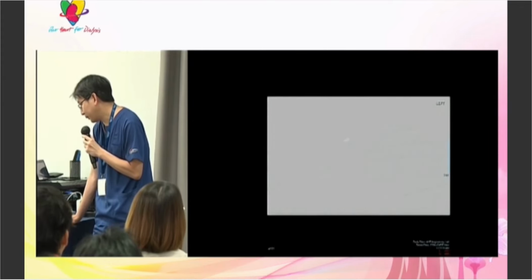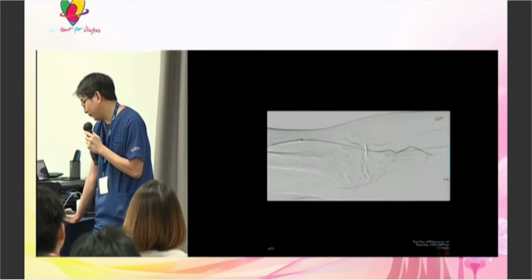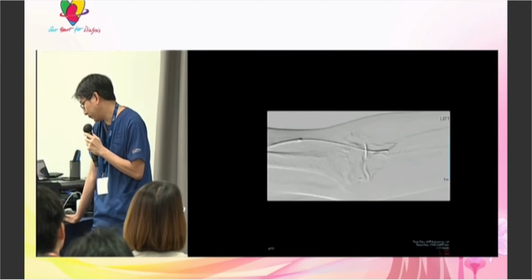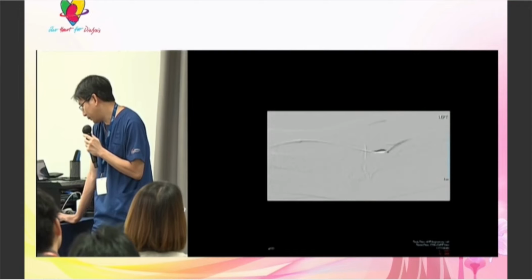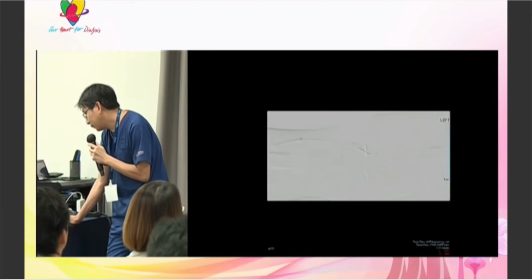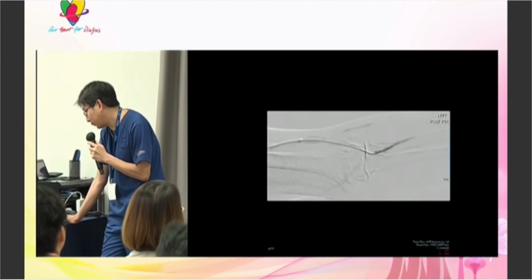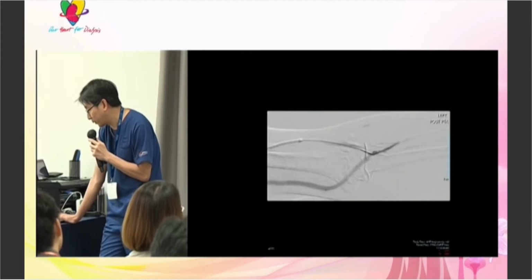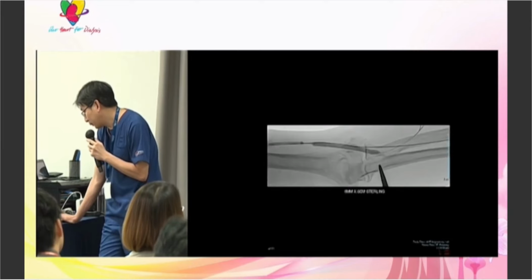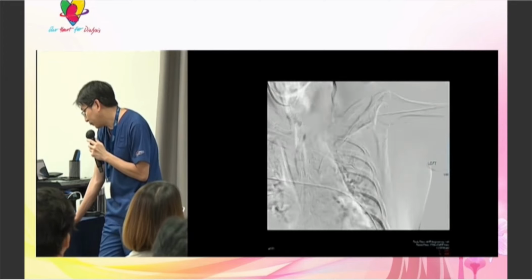Yeah, I did try ultrasound, but at the time I was still a little bit newer, so it was confusing, and I decided to just do what I could. So let's see. I'm just going to zoom through these. This is just me trying to find the anastomosis, and ultimately I couldn't quite find it, but I decided to try and mature up that very small cephalic vein, which is near the sheath. So I hit that with a 6 Sterling, and then did the rest of the runs.